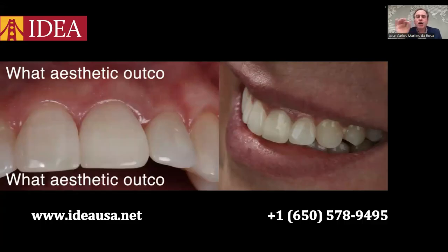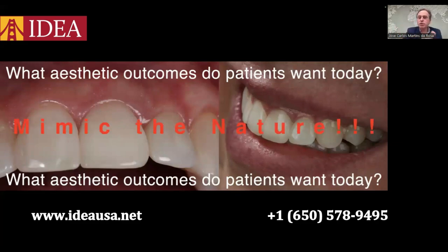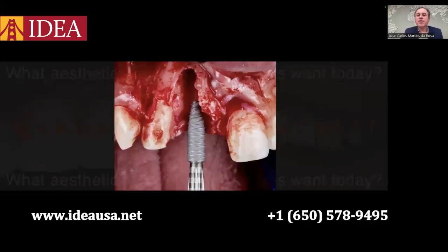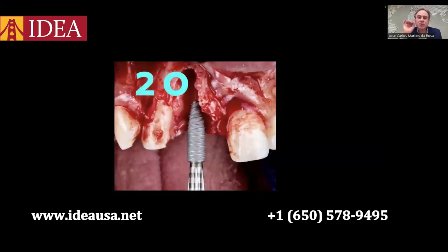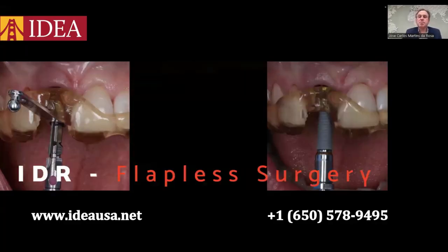So what aesthetic outcomes do patients want? What are they looking for? First of all, to mimic nature. If they lost bone, we are going to use autogenous bone. If they lost soft tissue, we are going to use autogenous soft tissue. The last time that we opened a flap to treat a case like this was in 2006, almost 20 years ago. Since then, we've been using a minimally invasive approach, flapless surgery, mainly using guided surgery to install the implant in the correct three-dimensional position.